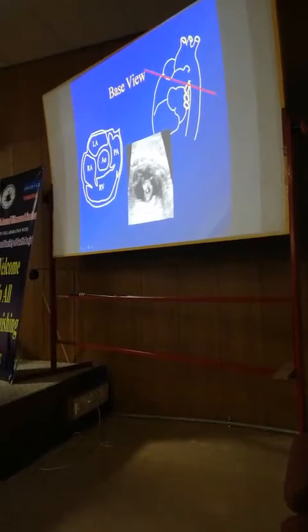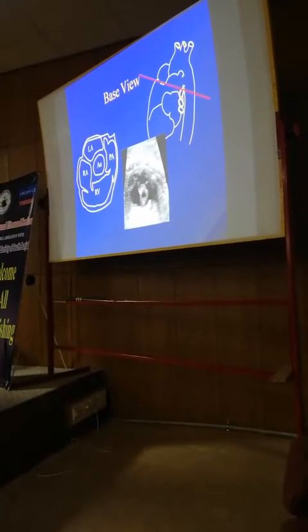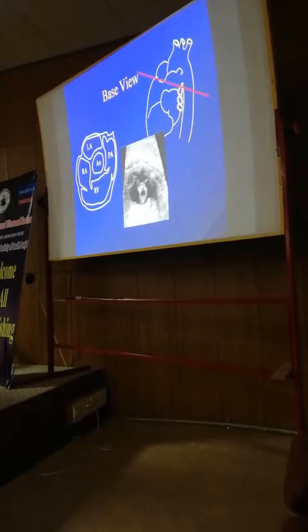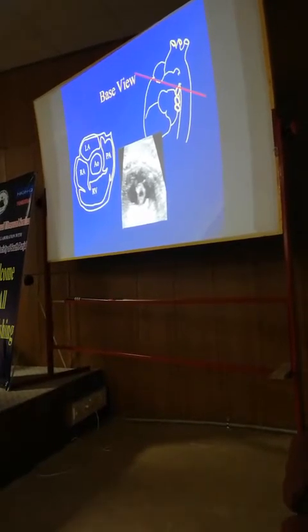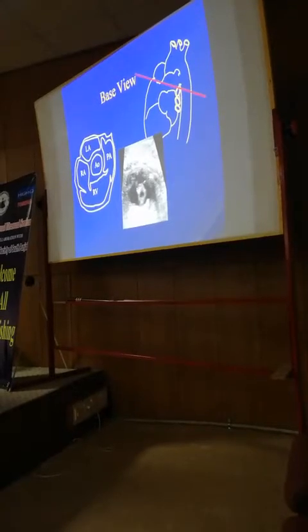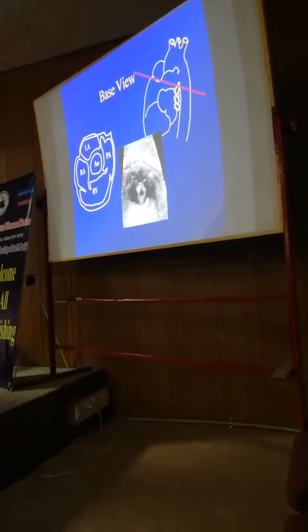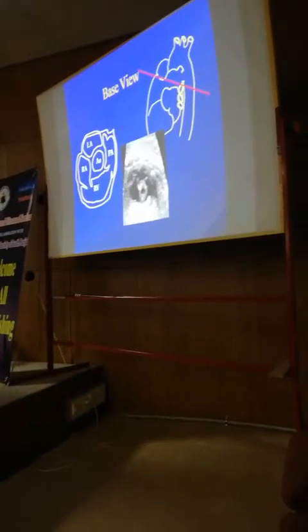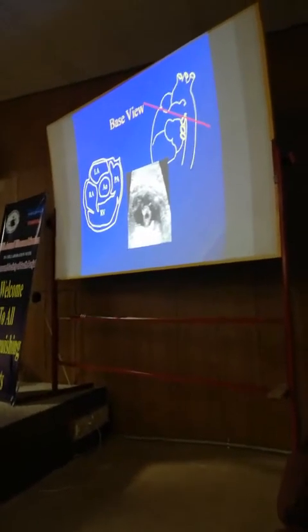So if you're seeing that, this just means that you're looking at normal structures, and your section is pretty high in the fetal thorax, and you are where you will start getting the most important section. We've not done the most important section yet. The most important section is going to come to us over the next few slides. And the most important section is going to be the 3 vessel trachea.